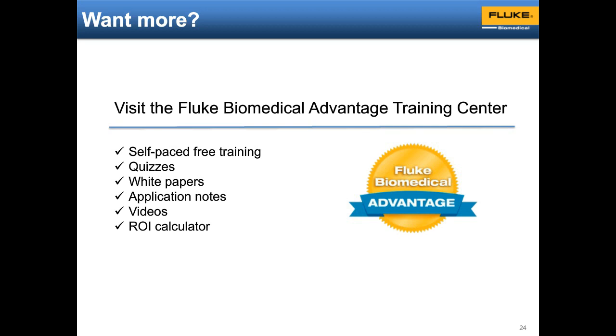Great. And what is there to be said about the R curve editor for Fluke products, if there is a process for approval for other manufacturers? Using our optional software, you can put in custom R curves. So manufacturers who use our device can do some testing with their probes that way. That's certainly a viable way to do it.